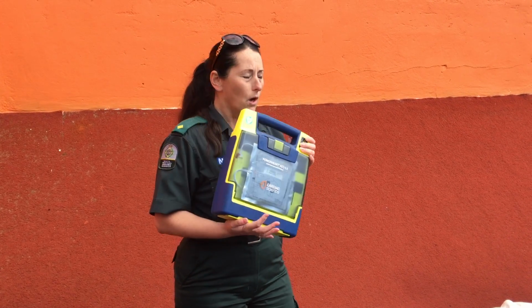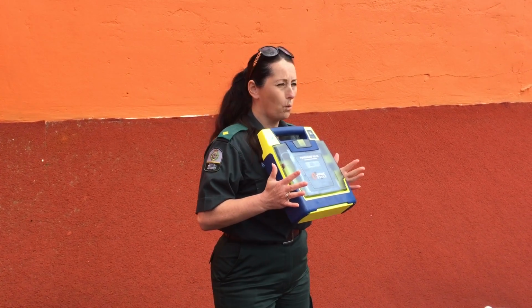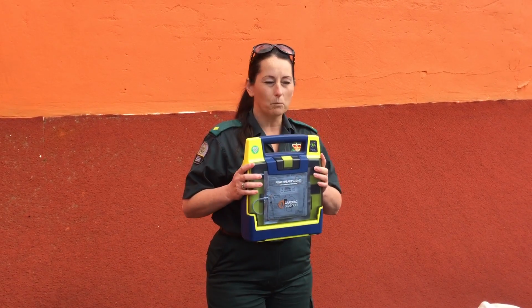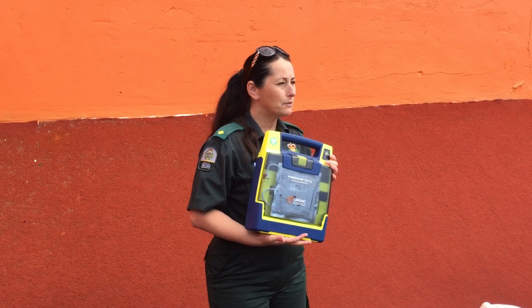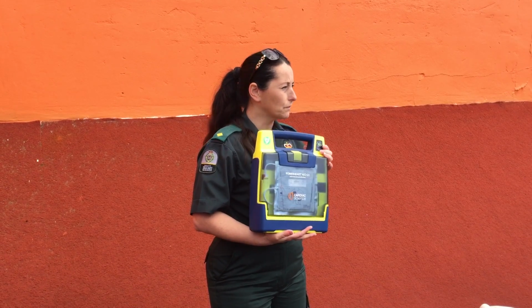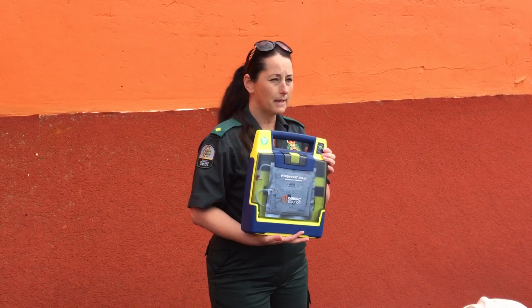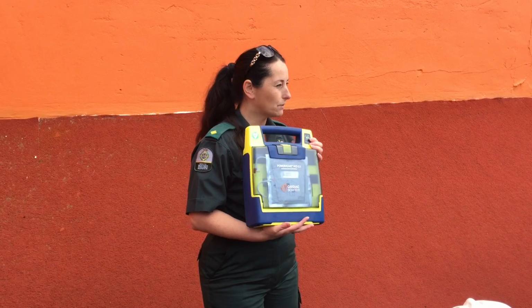Now, has anyone ever seen these around? I know they've got them all throughout Portishead. Yeah, they've got them outside Boots. The way that works is that it is in a locked cabinet, a green locked cabinet. If our ambulance service receives a call and you are within a 200-metre radius of any public access defib, you will be given the code to get the defibrillator out.